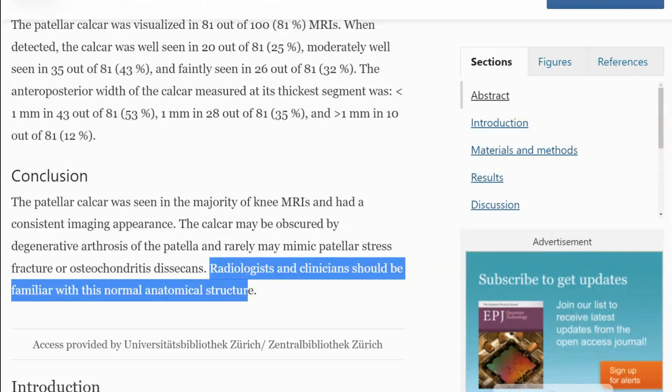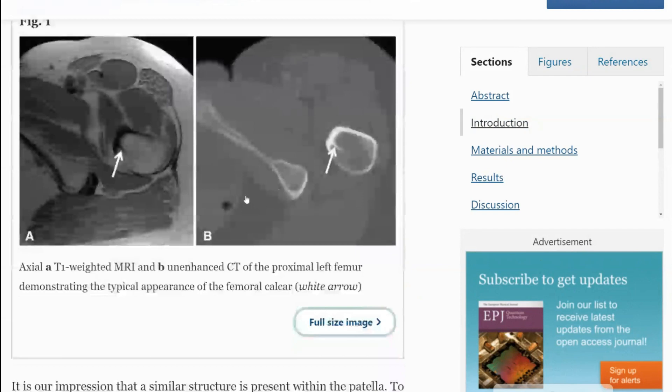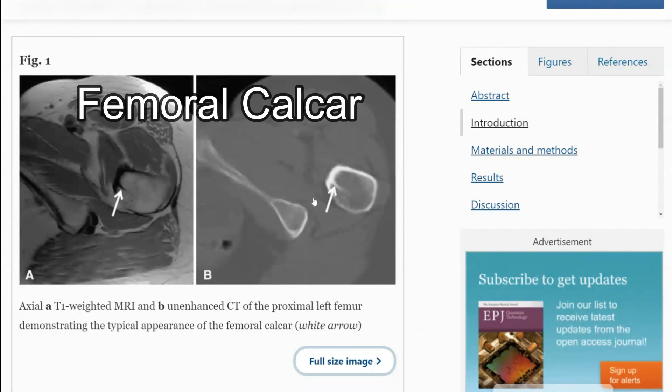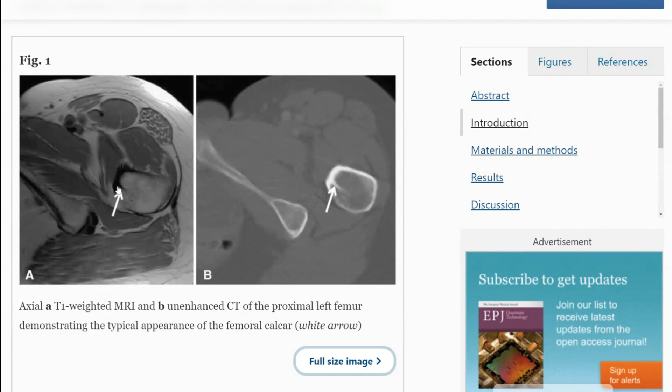The conclusion is it may mimic patellar stress fracture or osteochondritis dissecans, and radiologists and clinicians should be familiar with this anatomical entity. You're probably more familiar with the femoral calcar, which is a line that helps with force distribution. There are trabecular networks within bone that become more dense because of increased stress at that location — that's what's believed to create these calcars. As a side note, the femoral calcar was first described by a German clinician named Merkel in 1874.